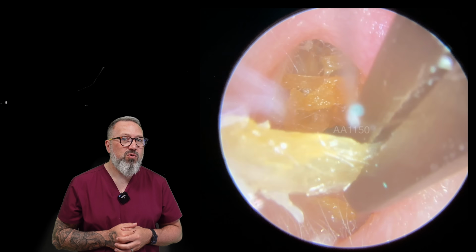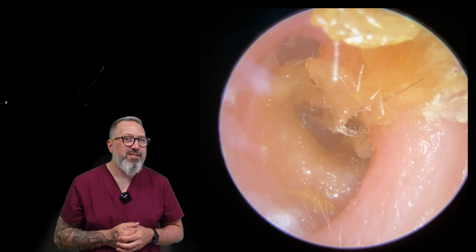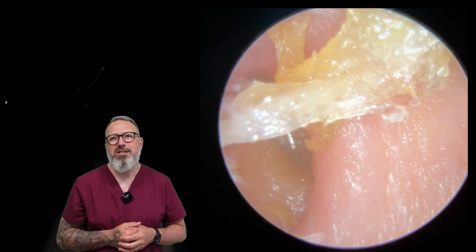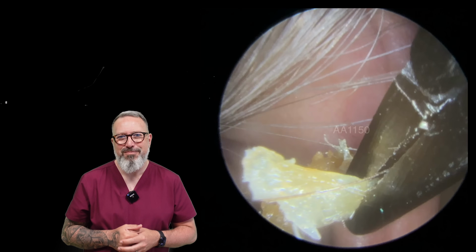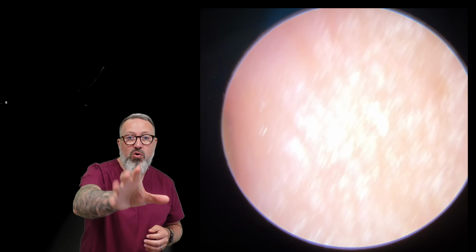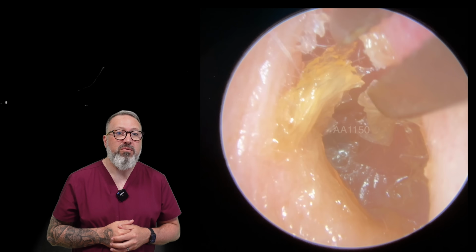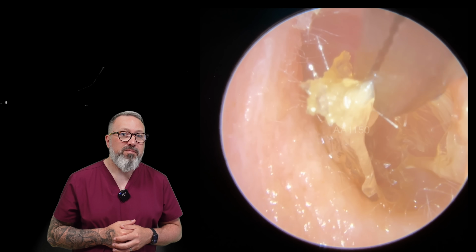And we're going to draw. I'm being really gentle here because look at this coming away. You know I love a good skin ribbon, guys. I was absolutely gutted that last little bit didn't stay attached to the piece behind. But it was quite a long old piece, that one. And now it's drawn all this away from the canal wall. If I just grip this top section, let's see if it peels the whole thing.